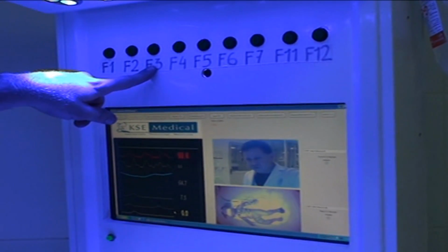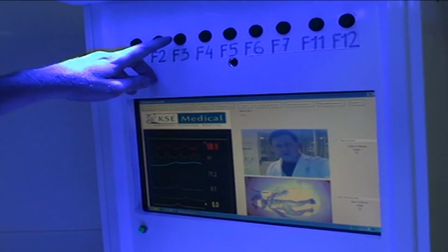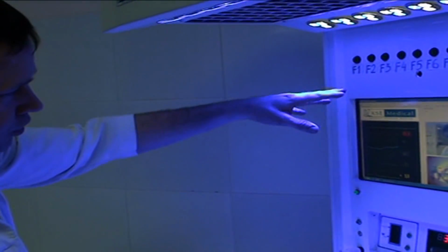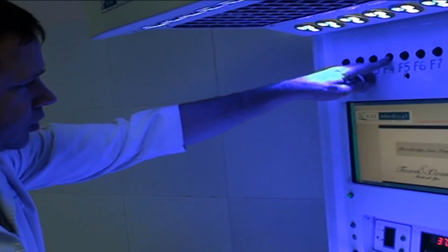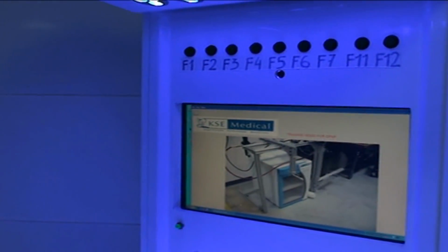This is save and resume. For example, you can have any configuration, doing anything you want, push and hold this button, and it will save and hold that configuration. You can go and do research. For example, watch the training video for phototherapy, or you can return and watch the training video for CPAP.